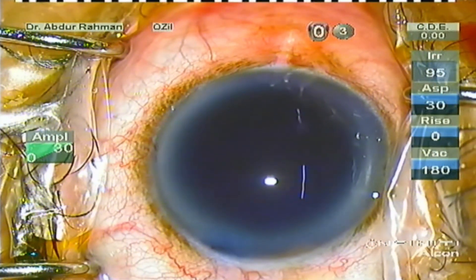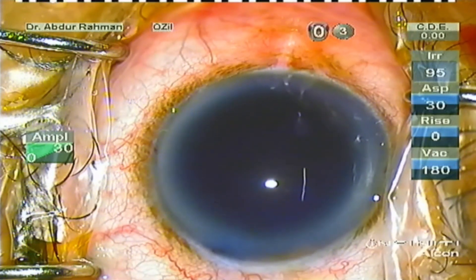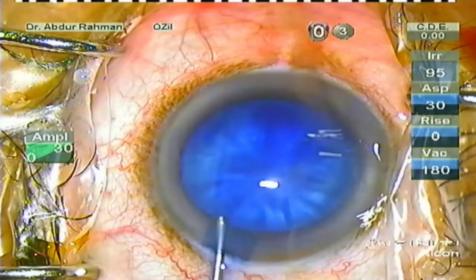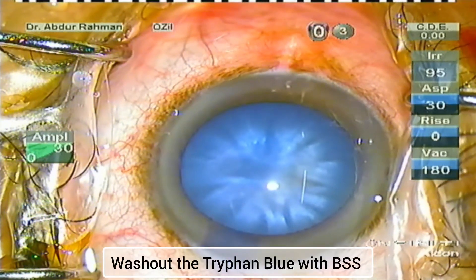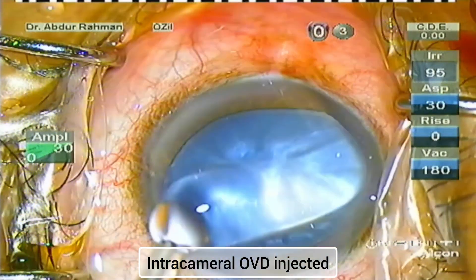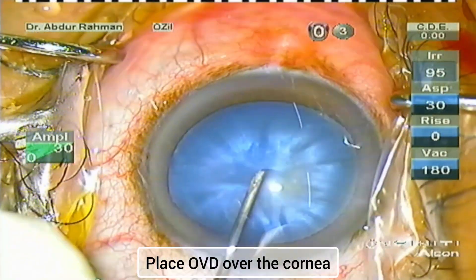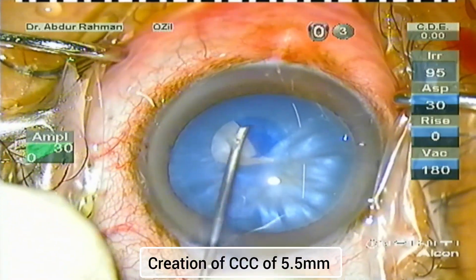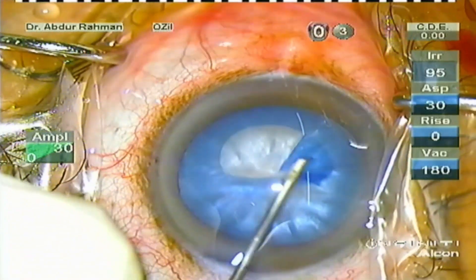The capsule is stained with trypan blue because it will help in identifying the capsule pretty well during construction of the capsulorrhexis. My goal is to create a 5.5 mm continuous curvilinear capsulorrhexis. I'm using the system to guide the rhexis flap in a circular manner and completing the rhexis.